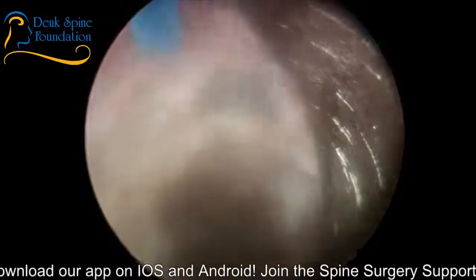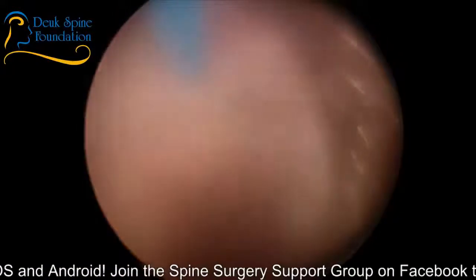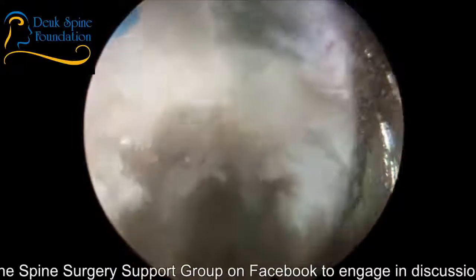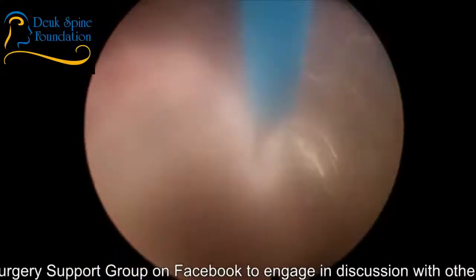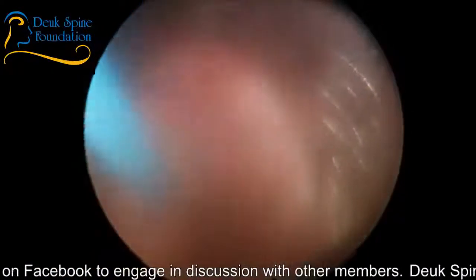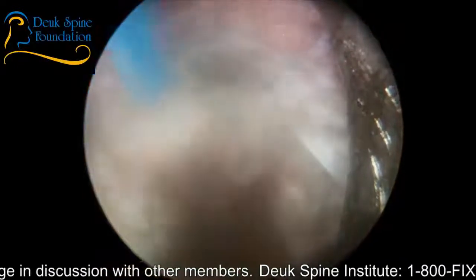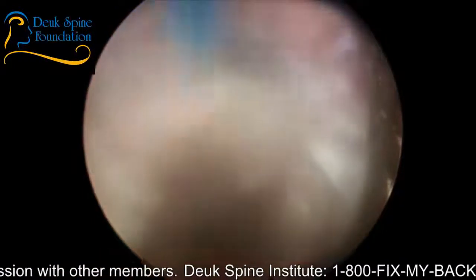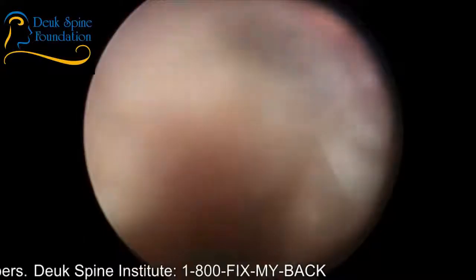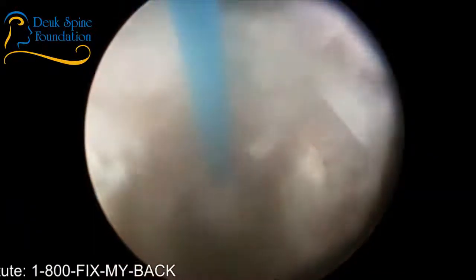Because of our trajectory where we are right here, we're able to get more of the herniation out than a standard paramedian approach, which is a microdiscectomy, because of our angle of attack coming more lateral. You can see the epidural veins. Luis, I need help getting this to the 12 o'clock. Just about done here at L5S1.